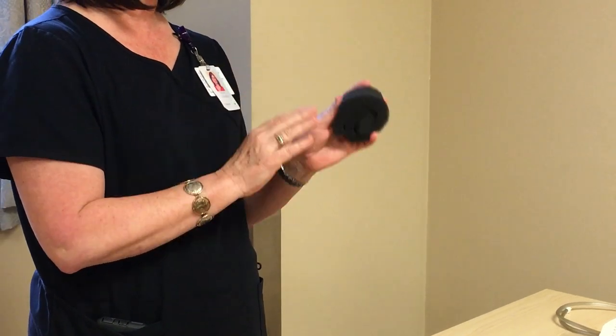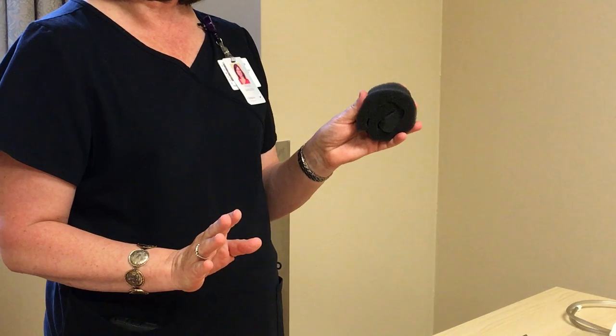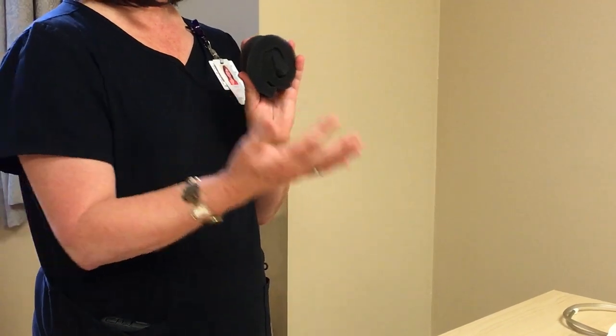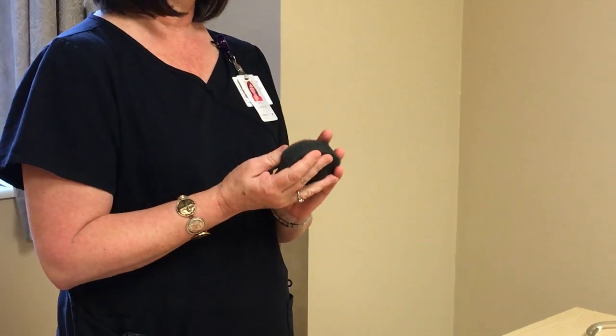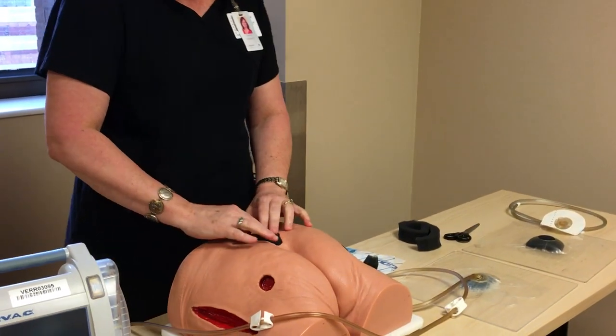The importance of that is that dressing changes should be done every 48 to 72 hours, and no longer than 72 hours, because if you don't, it can cause ingrowth of tissue into the foam, and it will be more difficult and more painful to remove it from your patient. So dressing changes every 48 to 72 hours.